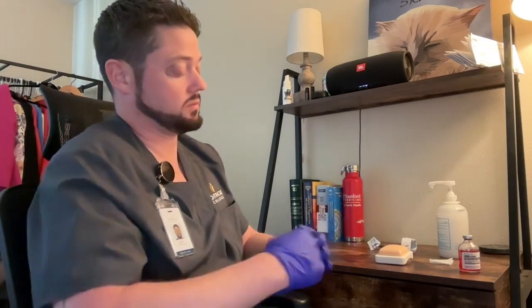If they do not, we will go ahead and remove our gloves. We will dispose of them in the biohazard container. We will apply hand hygiene. We will ask the patient if they need anything else, and if they do not, we will excuse ourselves from the room. We will go ahead and close the door for privacy, and we will go ahead and document the procedure.